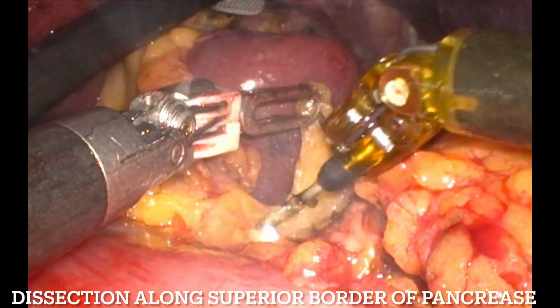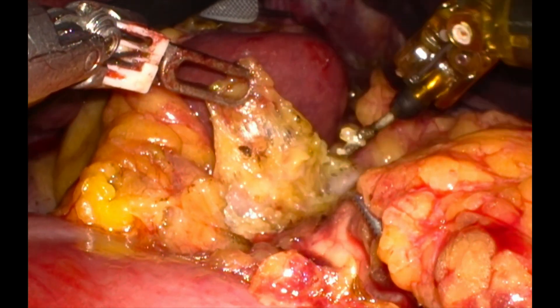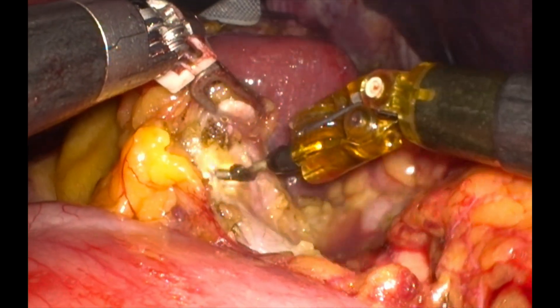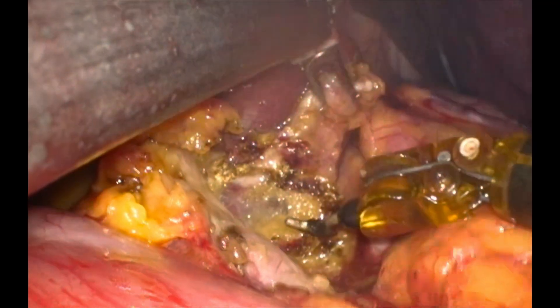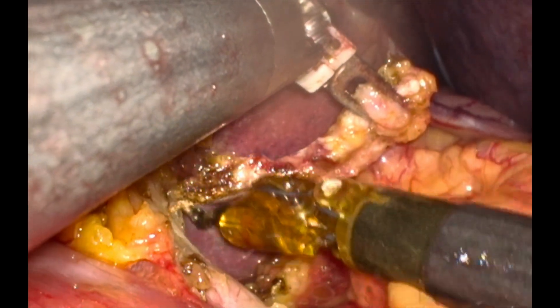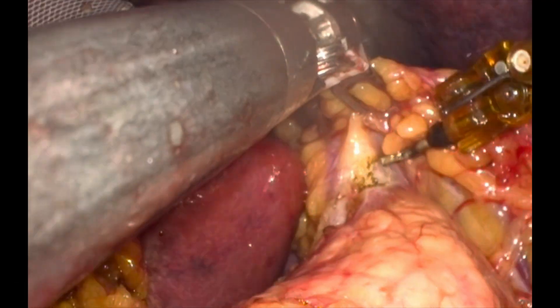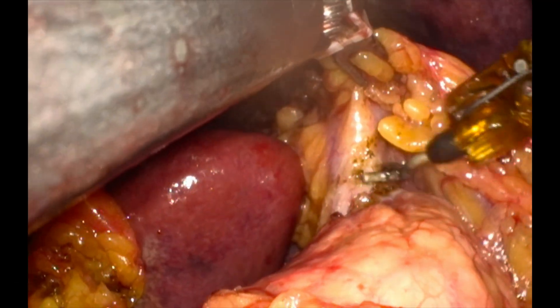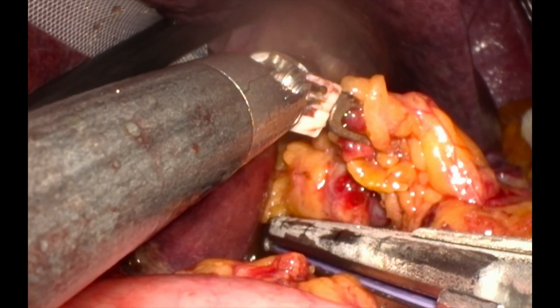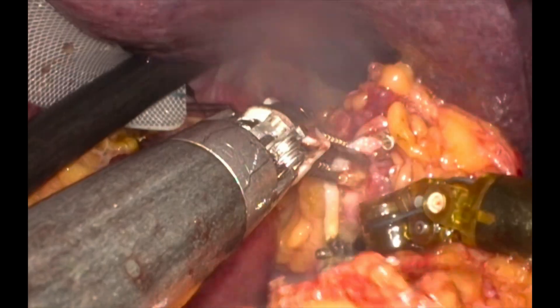We start our dissection along the superior border of the pancreas, taking all the nodes of level 8a, that is along the common hepatic artery. We have to be very careful with the gentle retraction of the pancreas. You can see the pancreatic tissue retracted as well as the common hepatic artery. All the nodes along the artery are carefully dissected out and removed. A huge node along the left gastric vessels is found — all are matted — so we took a vascular stapler and took both artery and vein together along with the node. We then proceeded with our dissection along the crus of the diaphragm.